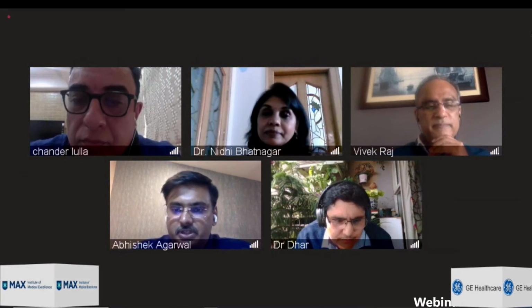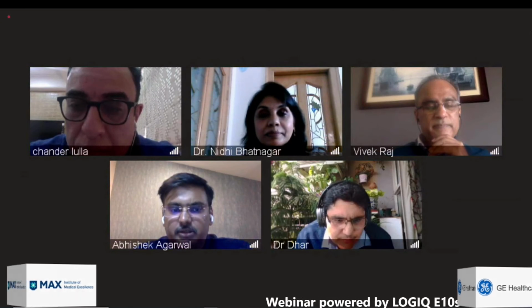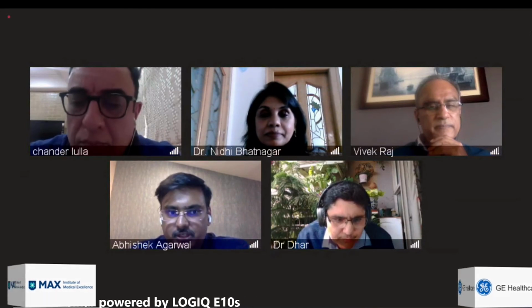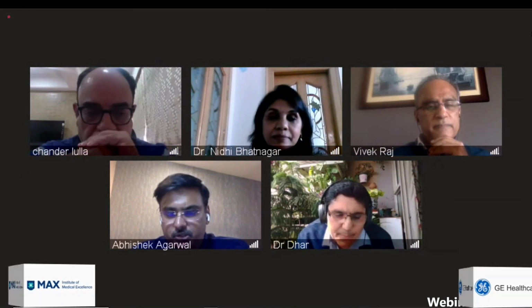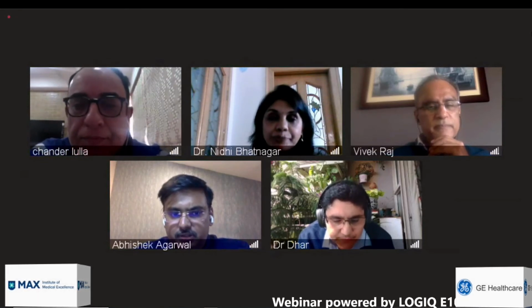Now, my question is, is there a similar sort of parameter in the TE elastographies that we do? Is there some sort of a quality parameter that tells you that the technician has done the job right? The FibroScan reports also have an IQR. The same IQR.